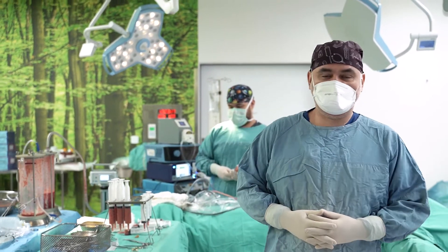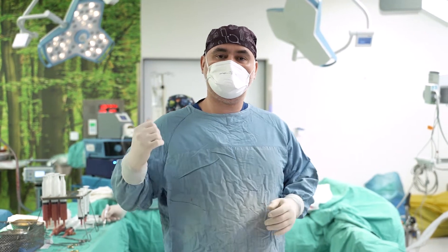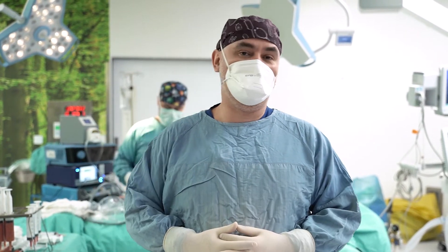Now we have finished the front side. We aspirated the fat from the abdomen and flanks and injected the fat into the hip regions. Now we will turn the patient. We will aspirate the fat from the back side to decrease the back size, and after that we will inject the fat into the butt region to increase the butt area, and then we will finish our surgery.